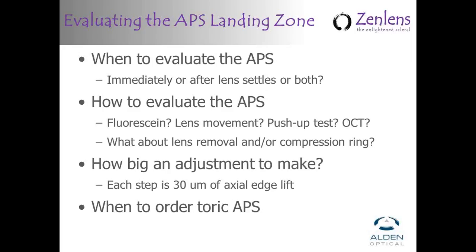I would just assume not see any movement whatsoever. To me, movement means the edges are loose in some area, and that's asking for debris accumulation and fogging, or it indicates that the sclera itself is toric and you're getting a rocking back and forth of the lens, and that's not good either. Again, a well-fitted scleral to me exhibits zero movement, but it exhibits peripheral curves that with gentle manipulation with the lid give up or allow fluorescein to pass fairly freely.